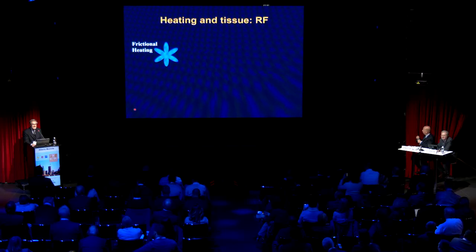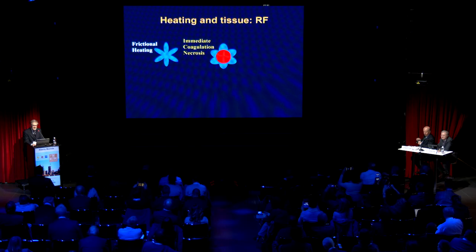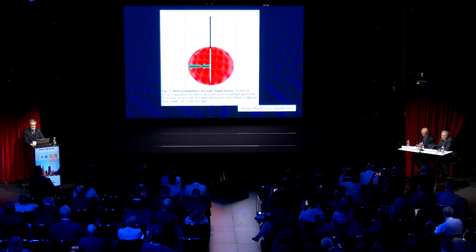We have frictional heating, with immediate coagulation necrosis near the needle, and then, over time, with conductive heating, we have a larger area of ablation. This is the same concept: near the needle, friction, and over time, conductive heat, a larger ablation area.